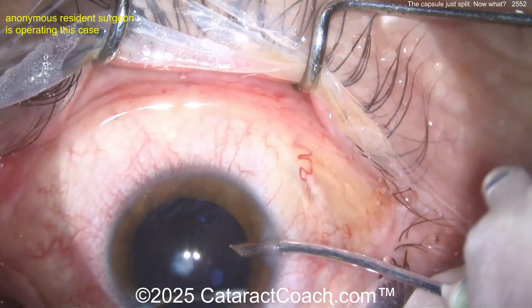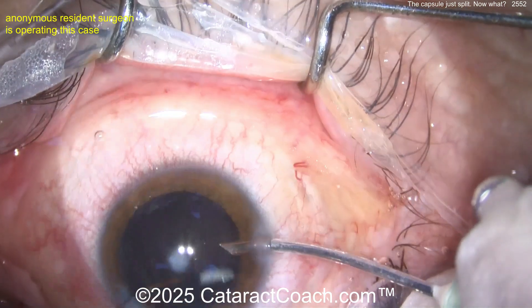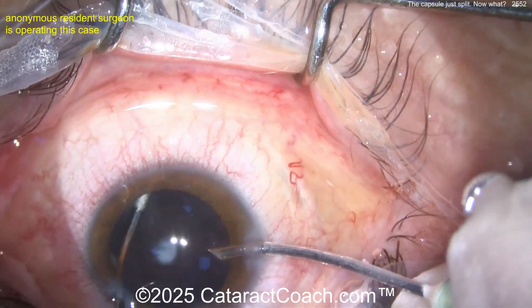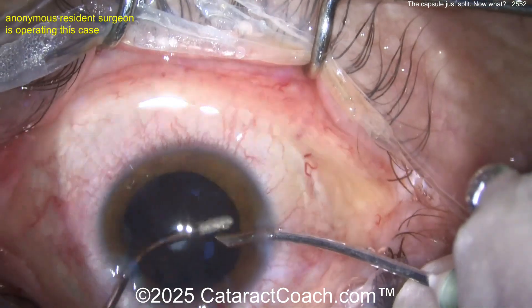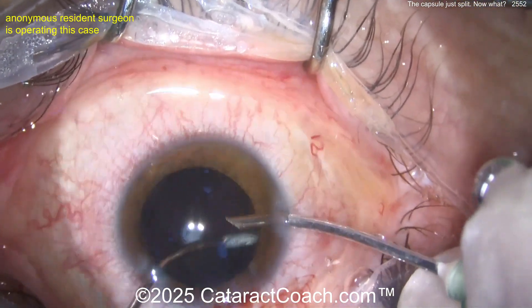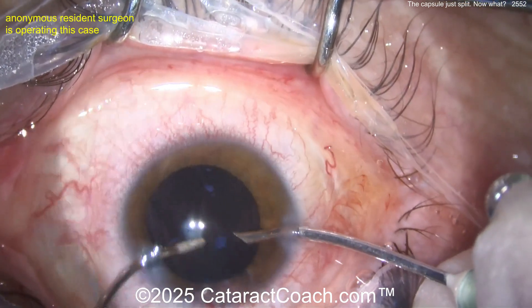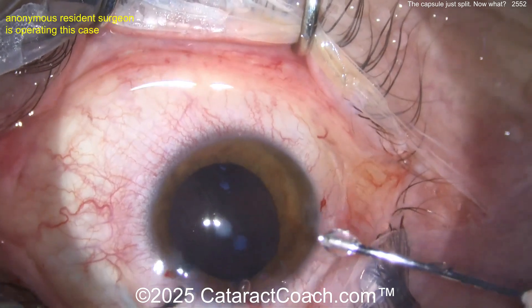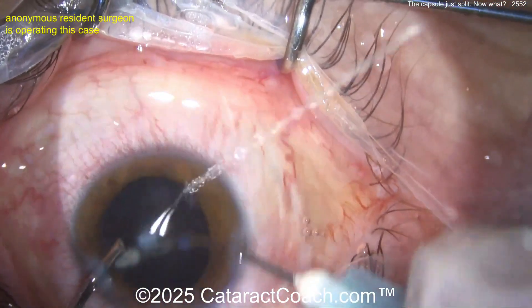Be careful — don't grab the anterior capsule when you're doing this, because if you grab it where the capsule ran out, you can cause it to rip all the way back to the posterior capsule too. Can we be less aggressive on this? I worry about that central opacity in the middle — that's the one that's going to affect the patient's vision. I wouldn't care so much about polishing up the lens capsular bag equator; that doesn't make any difference.